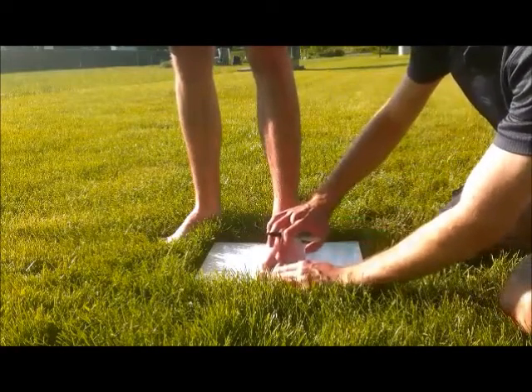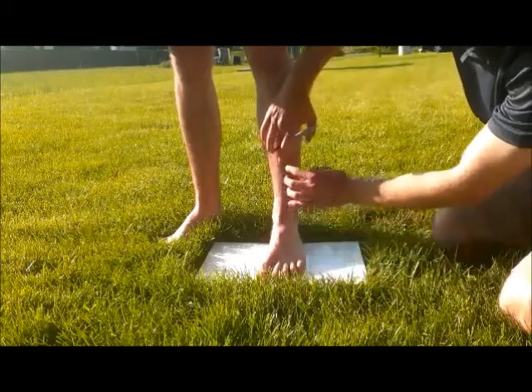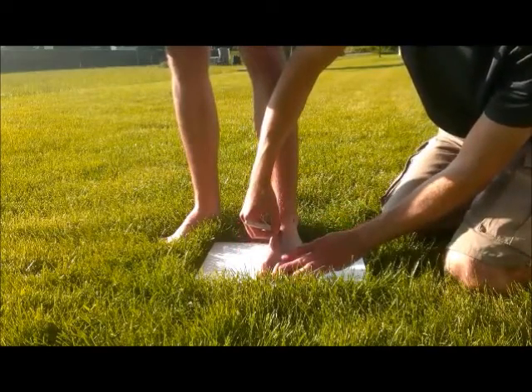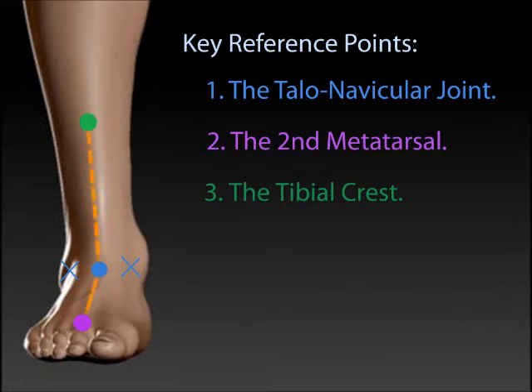Next, mark the second metatarsal head. Finally, mark the tibial crest. The tibial crest can be easily identified by running your finger above your shin and feeling that slight bump. Now draw a dotted line down from the tibial crest to the bisection point, and draw a similar dotted line from the second metatarsal head again to the bisection point. When you're making your arch, you'll want these to align.